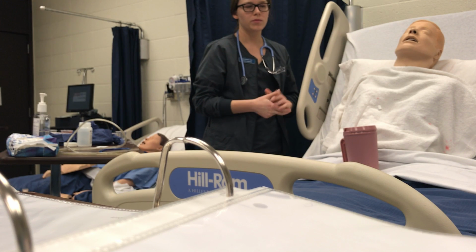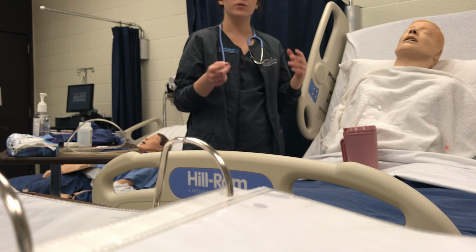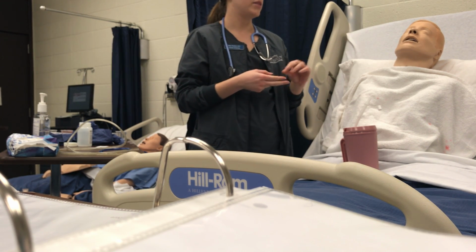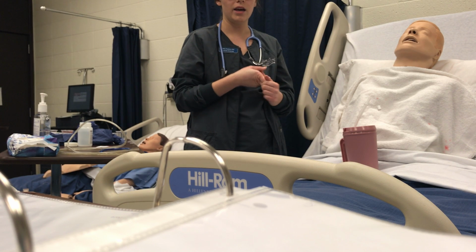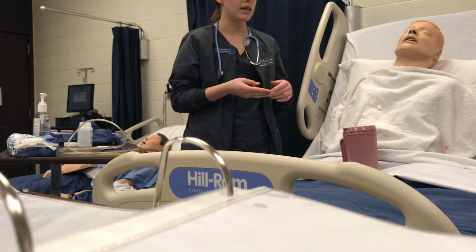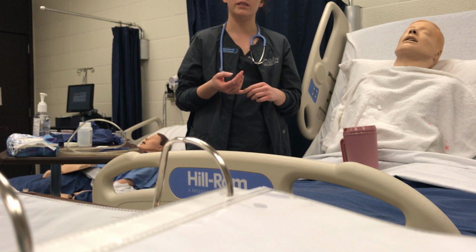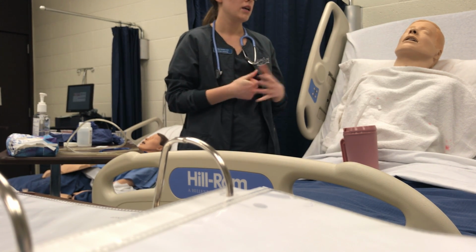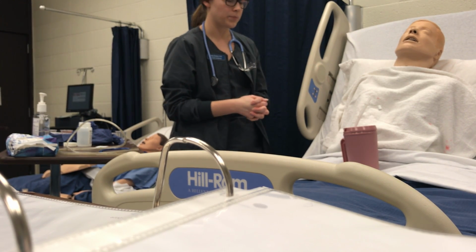I want to assess for a few things. I want to assess if they've had any kind of surgery in relation to the nose. I'd also want to make sure that their nostrils were patent, that they didn't have a deviated septum or anything like that, that their gag reflex is intact, and I also want to assess their mental status and see what their cooperation level is, because this procedure does take some cooperation on the patient's part.